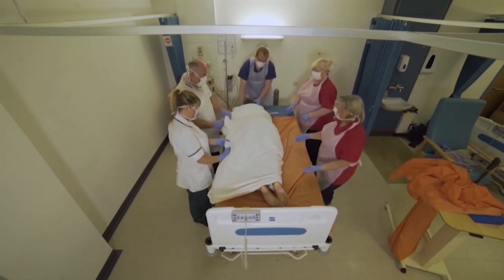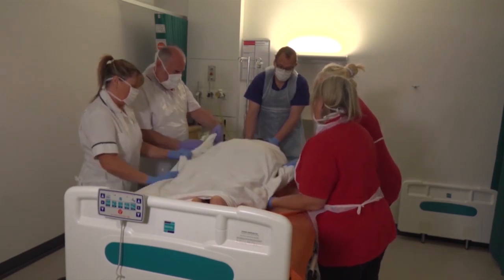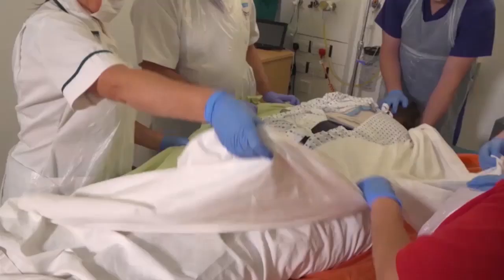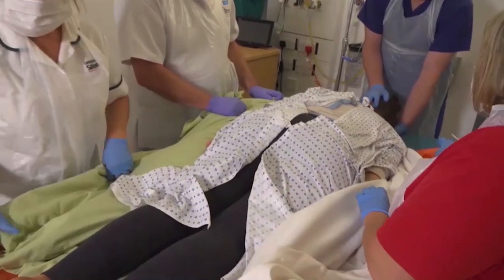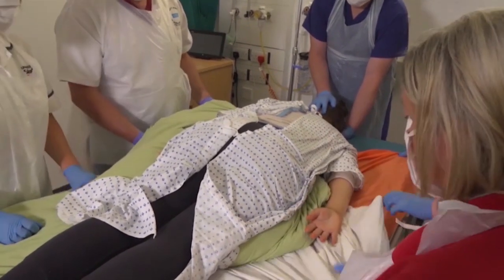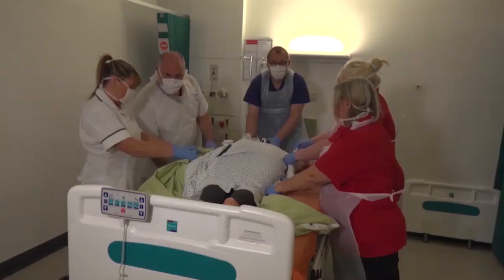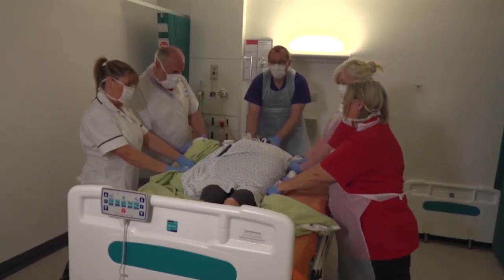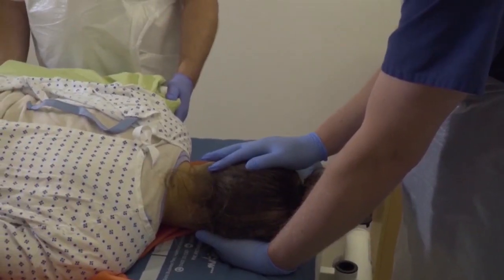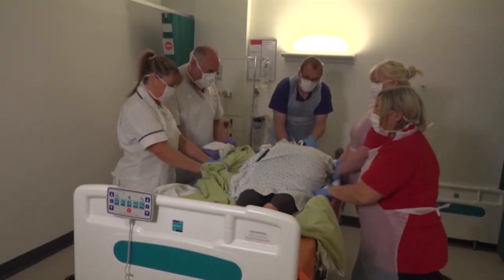We can now position our person. Let's get the sheet out, unravel all the sheets, and we can take it off. You're just going to give a little push — that's all, you're not really doing anything. You're managing the head; otherwise the face will drag. Ready, steady. Fabulous.